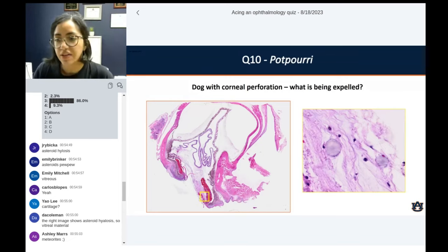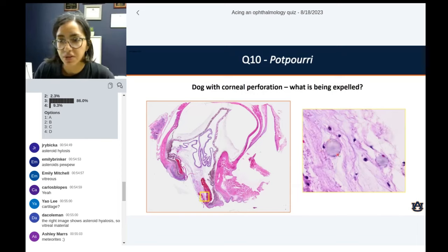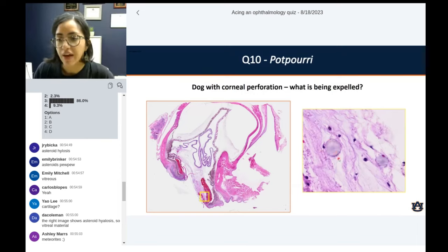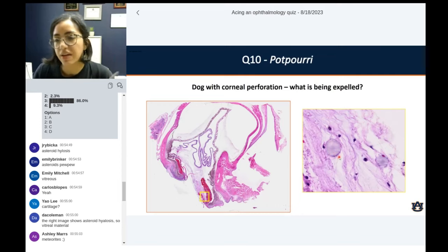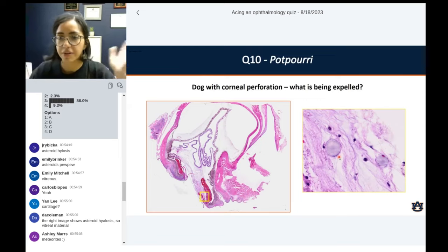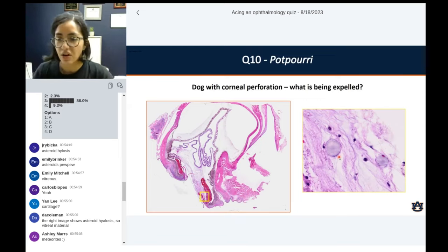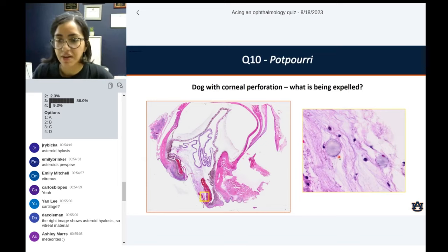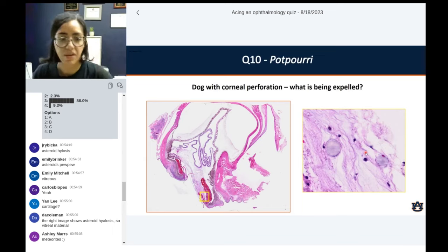This is vitreous — it is a sign. This dog had degeneration of the vitreous, probably age-related, and now it's being extruded from the defect. The lens is gone, part of the iris is gone — it's just a mess. But yes, this is vitreous, so vitreous is just out of here.